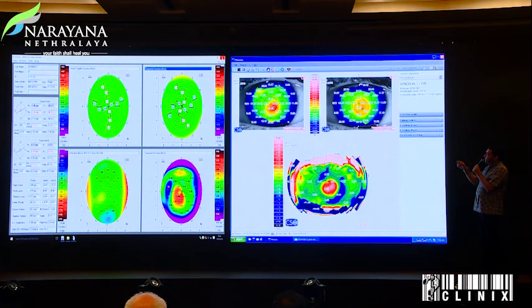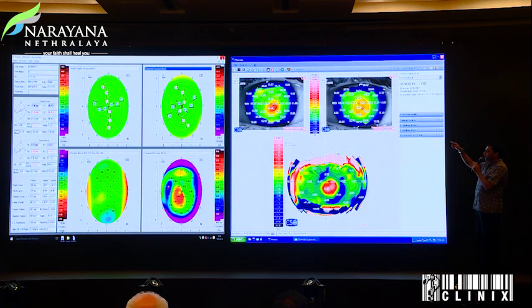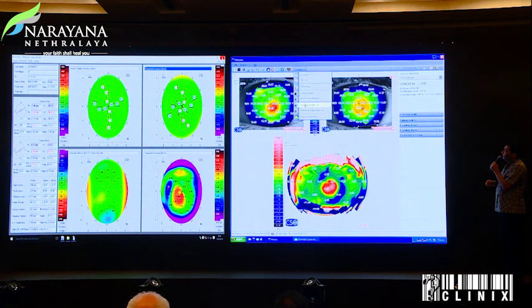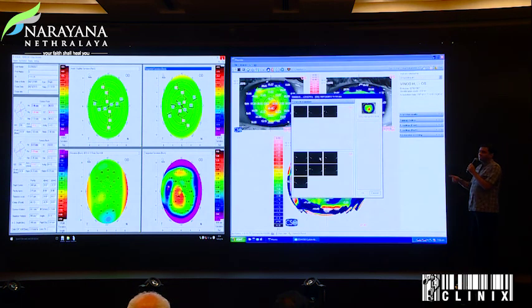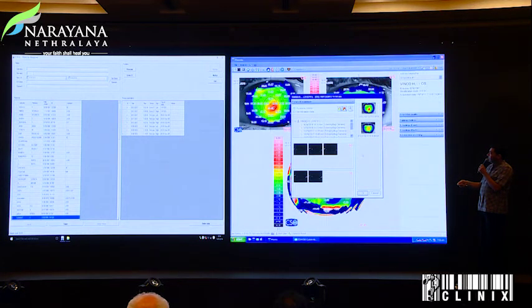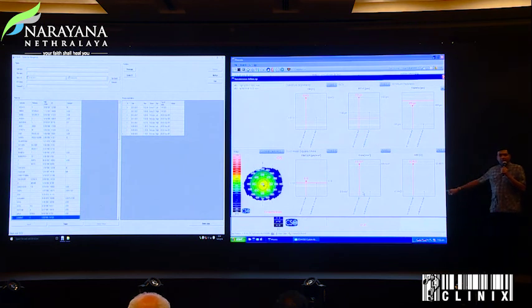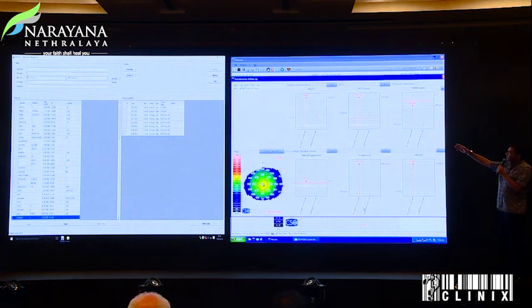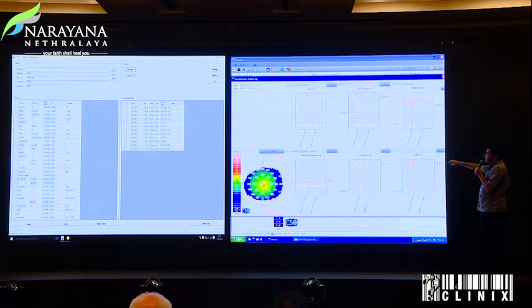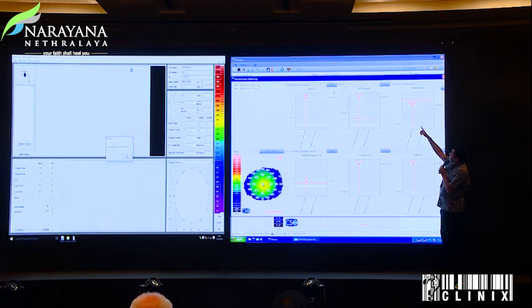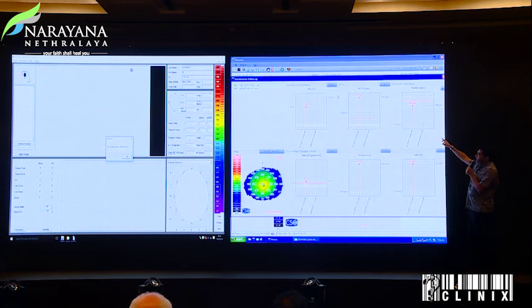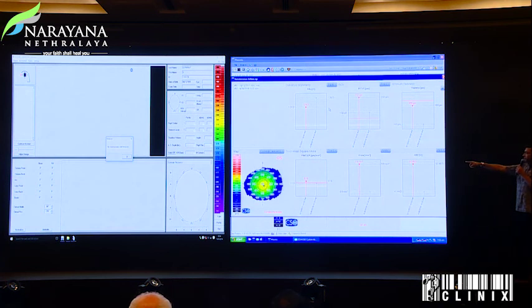Just go to the compare indices. You can see the pre and the post, which we all know. But there is one where you have indices and keratoconus follow-up. This is very interesting — use this in your follow-up patients, because it compares whatever indices were mentioned. It gives you this from two visits. It tells you the front BCV. You can change it to the back, and there are some more options you can check.